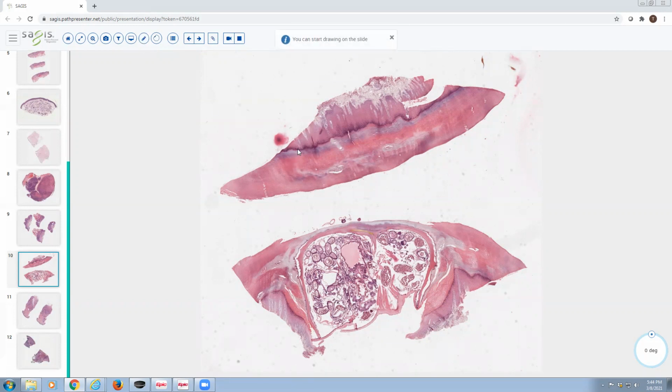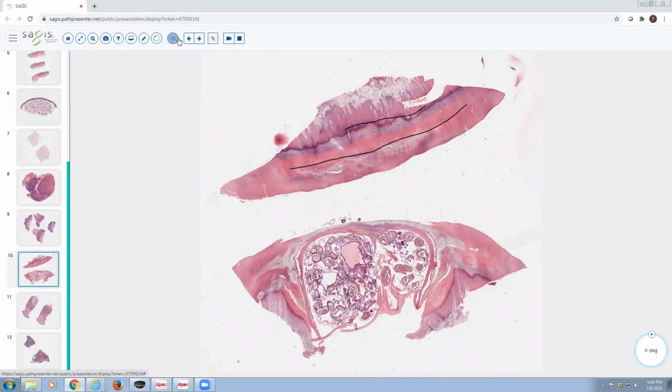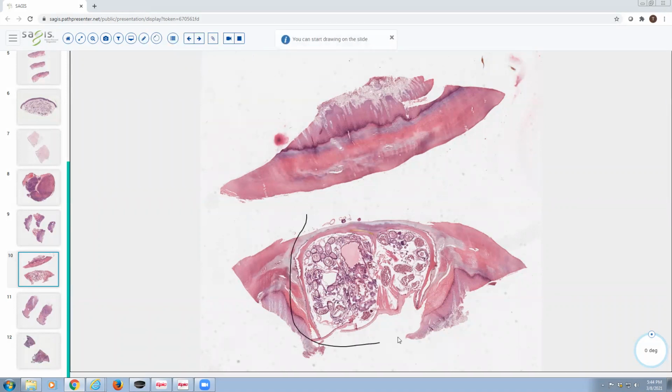You've got a thick cornified layer. You've got hypergranulosis, and you've got acanthosis. So that's the overall kind of situation, is that we're on acral skin. And then burrowed within that acral skin is your flea, your organism. And it's usually situated kind of under a thin shell of cornified material, and it penetrates down into the granular cell layer. That's really as far as it goes. It doesn't go down into the dermis.